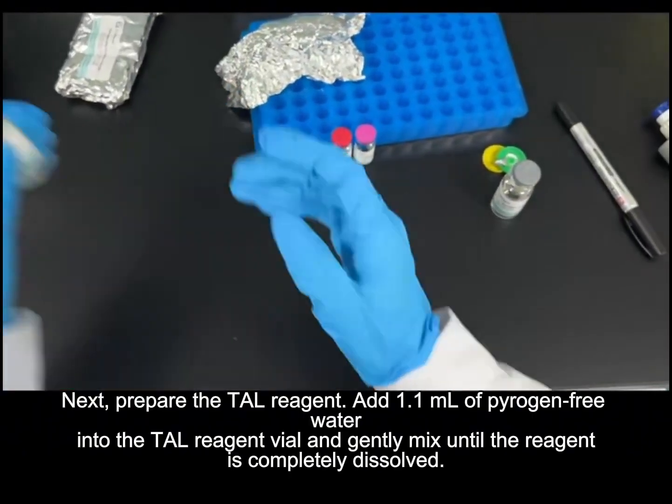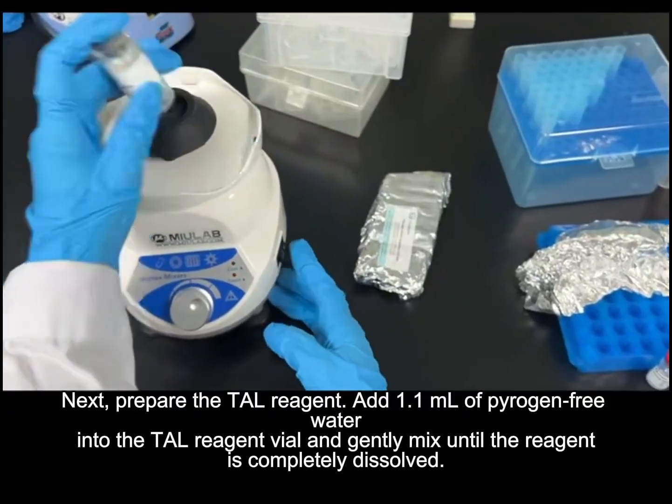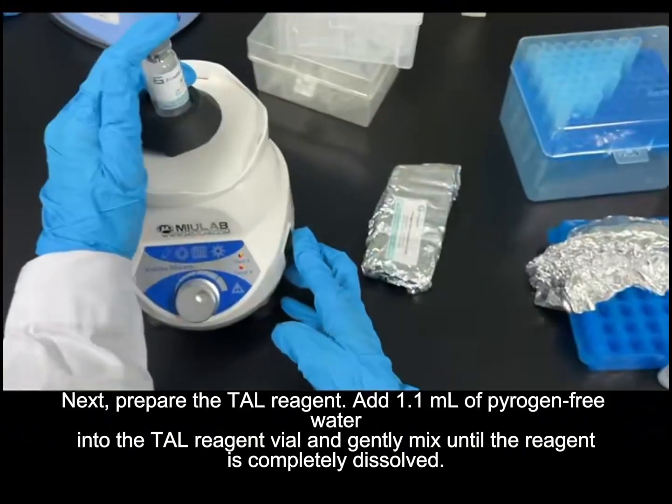Next, prepare the TAL reagent. Add 1.1 ml of pyrogen-free water into the TAL reagent vial and gently mix until the reagent is completely dissolved.